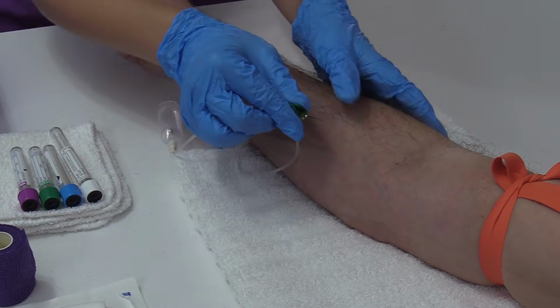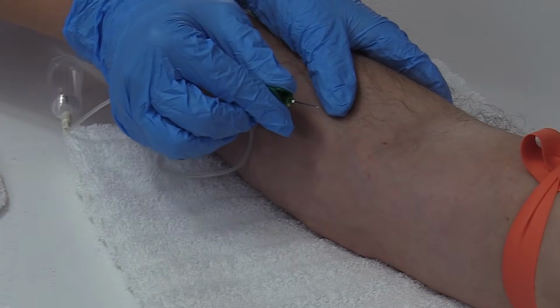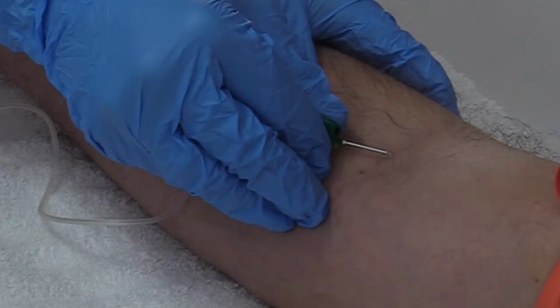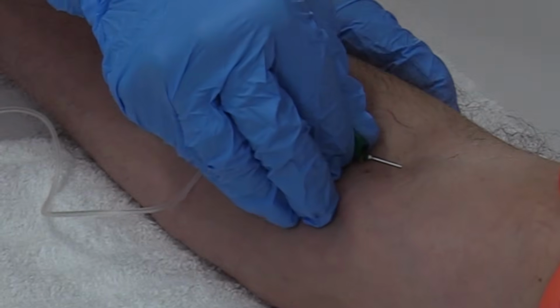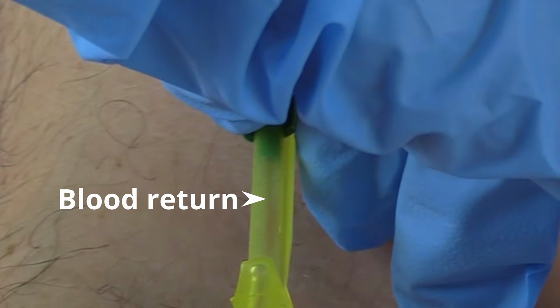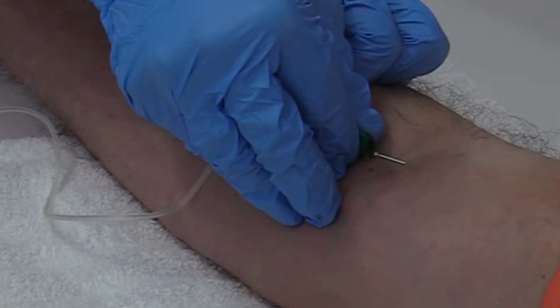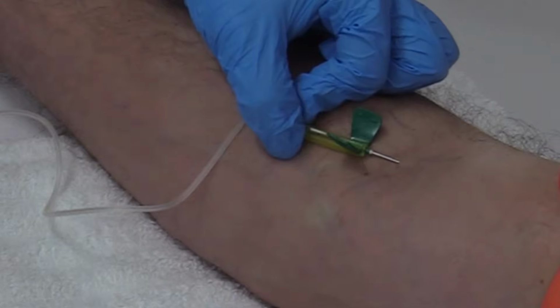So I'm going to anchor the vein just a little bit by going 1 to 2 inches below the insertion site and pulling the skin taut. Then I'm going to insert at about a 15 to 30 degree angle. I'm looking for blood return, which I have, and I'm just going to seat my needle a little bit. So I've lowered my angle and insert about 1 to 2 more millimeters, about a thickness of a nickel. Now I'm just going to stabilize it.